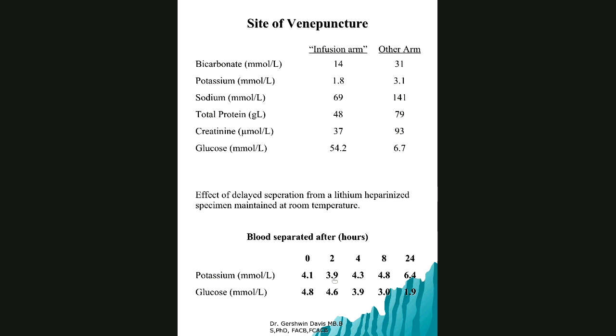But what happens here is not hemolysis, which can increase potassium, but potassium actually leaking from the cells because this is delayed separation. Right? So as you move from 0 to 4, 8, 24 hours, you find that the potassium is actually leaking. In the real world scenario, blood is taken for potassium in a red top tube and then sits on the desktop. Over time, in contact with the serum, the potassium leaks and leaks from the cells, and you get a high potassium.